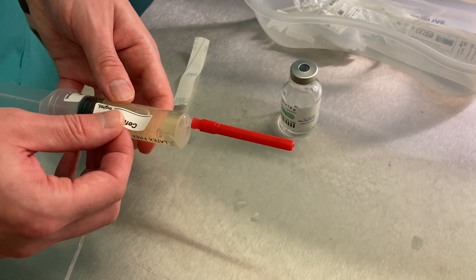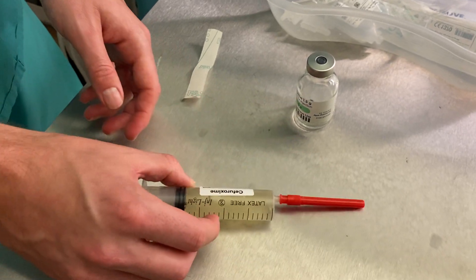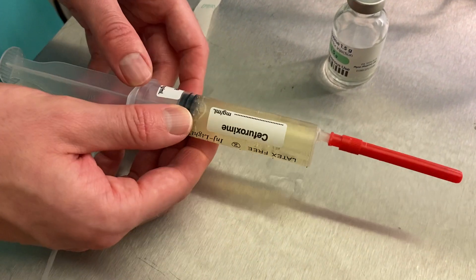Labelling now, nice and clearly. Never leave a syringe down out of your hand or out of sight without labelling it, for safety reasons.